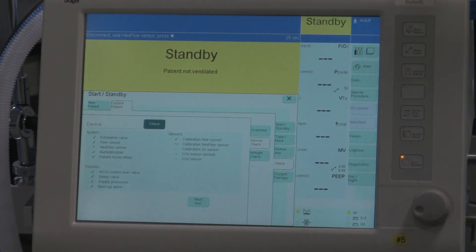It says 'Disconnect and seal neoflow sensor.' We're going to go to 'Next test' because we don't have the neoflow device in place. Now it's doing its oxygen calibration — this is where it checks the built-in fuel cell for the oxygen analyzer that's incorporated into this ventilator. Calibration is okay. Now we don't have any end-tidal CO2 monitoring devices turned on right now. If we did, we would do the CO2 sensor zero test and check on that. So at this point we're done with all the checks.